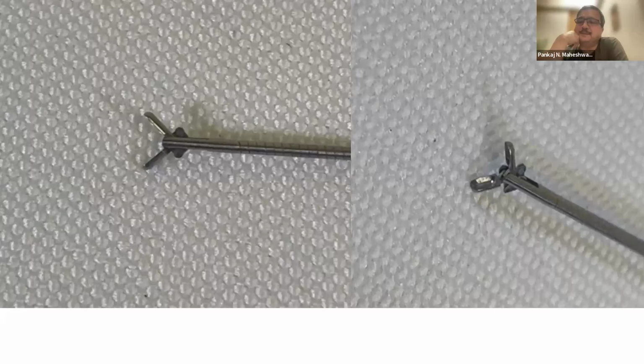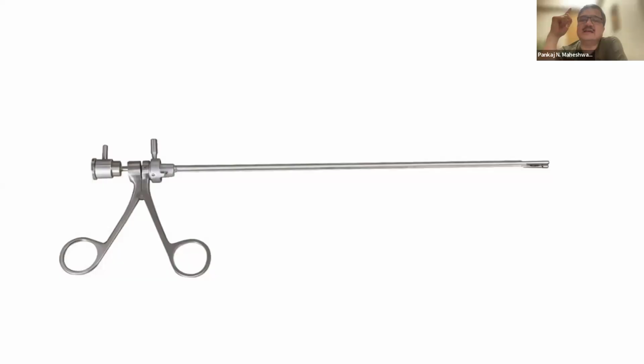Why do you have that cup in the biopsy forceps? Sir, to hold on to the lesion and to prevent the bladder mucosal. It is there so that the tissue doesn't get crushed inside your forceps. So the cup has slightly sharper edges.